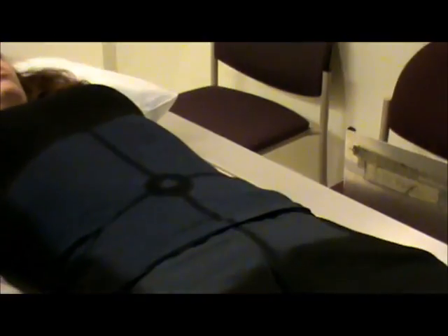We're going to use a right marker. Our borders: collimation up and down, skin margins side to side. Technique is going to be 77 to 81 kV. After we make the exposure on this with the patient on expiration, we're going to take it to the radiologist. He looks at the films, and then we come back and inject the contrast.